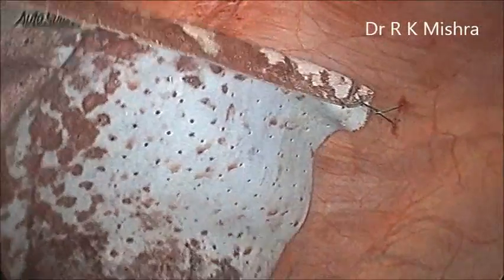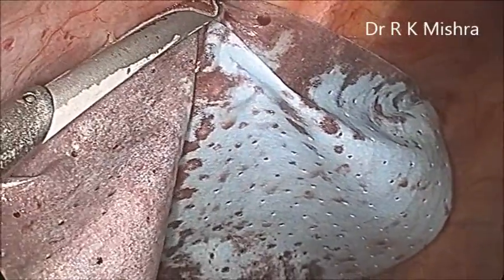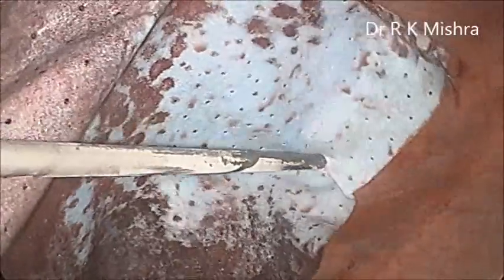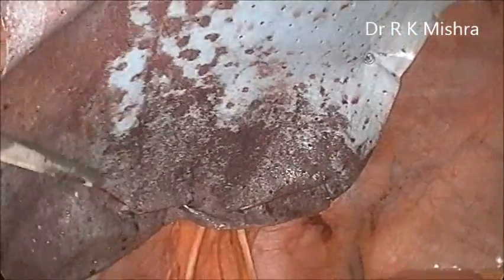In some rabbit experiments they have proven that after a few months of surgery, when they cut the abdomen of the rabbit to see — after putting the dual mesh — there was no adhesion. Here you can see multiple tackers have been used. The amount of tackers you will apply — fire all around — so that the mesh can be nicely spread all over. Care should be taken that accidentally tackers should not be fired into the inferior epigastric vessel.